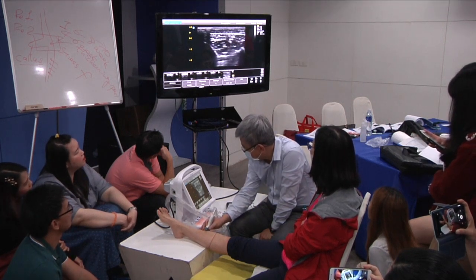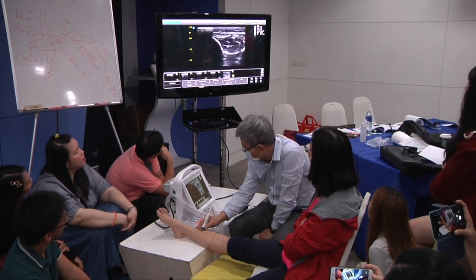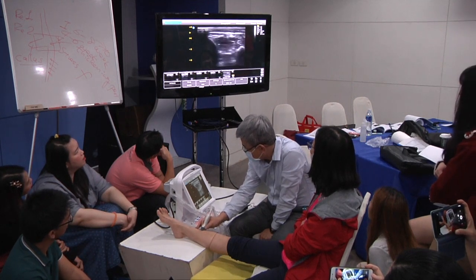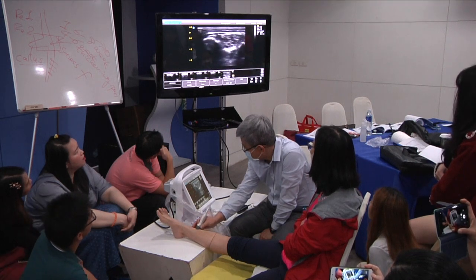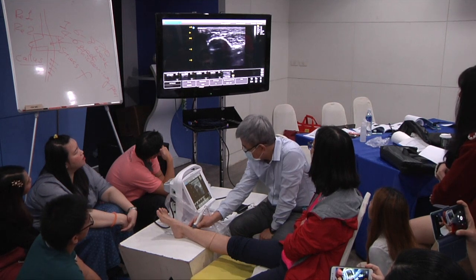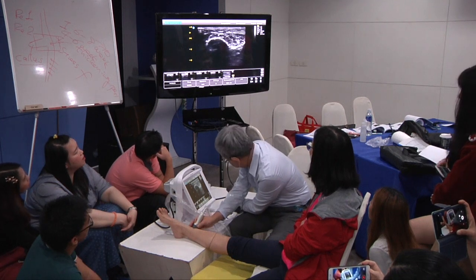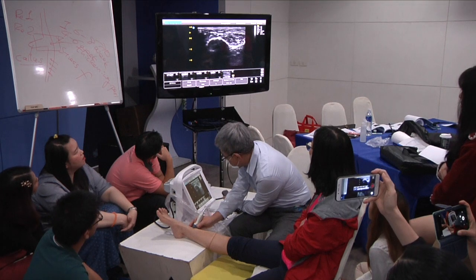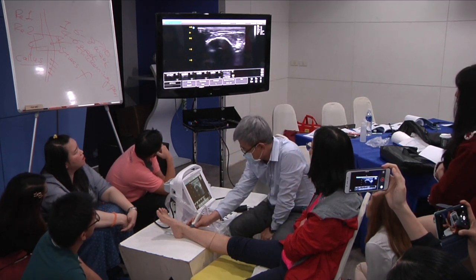Tendon. Go. That's the tendon for extensor hallucis longus. All right, this is the tendon. Okay, good. So the tendon of the tibialis anterior has already crossed the tibia, right? Extensor hallucis longus still stays in front of the tibia. Go.